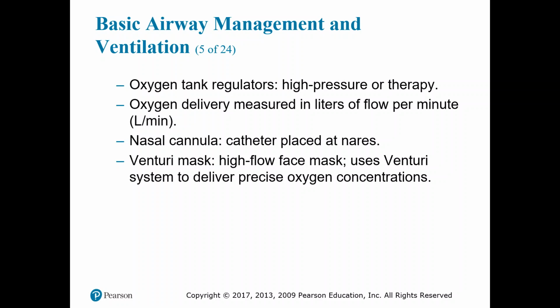And they will provide an optimal oxygen supplementation or an oxygen delivery of up to 40% when set at 6 liters per minute. Now, anybody that's had 6 liters per minute blowing in their nose knows that it is not comfortable, and it will dry you out pretty quickly. So I wouldn't want to leave a higher flow rate nasal cannula in for any longer than you absolutely have to. But if they won't tolerate moving up to a simple face mask, or you don't have a simple face mask and they won't tolerate a non-rebreather or a partial rebreather, they may just have to suffer through the nasal cannula for a little bit.